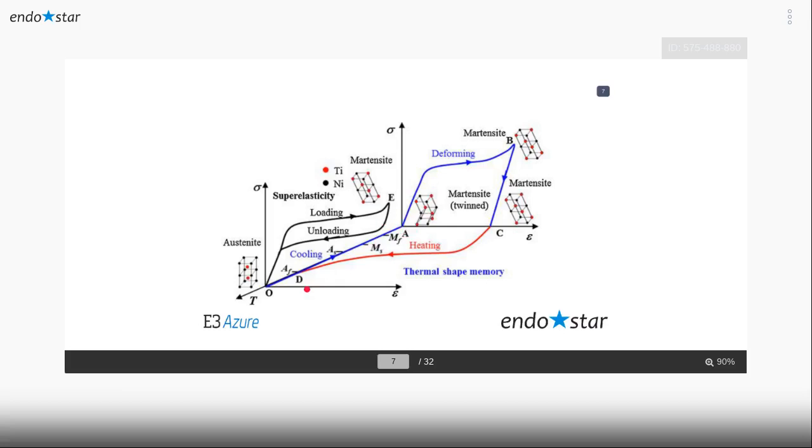So when we produce a file from the austenitic parent phase and it's stable in the martensitic phase, and you go and use it inside your tooth, it will undergo deformation. Martensitic already as a matrix is a twinned phase, so it will go under deformation to the detwinned phase. In this case, the file takes more force and more deformation and still no fracture.